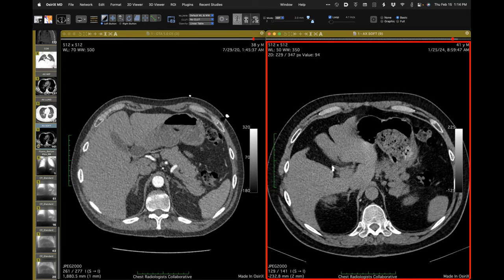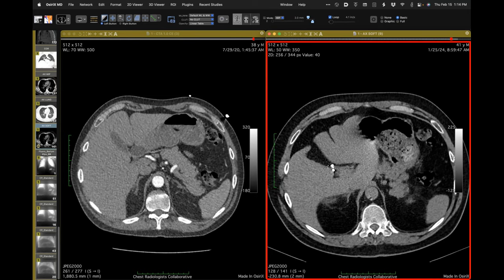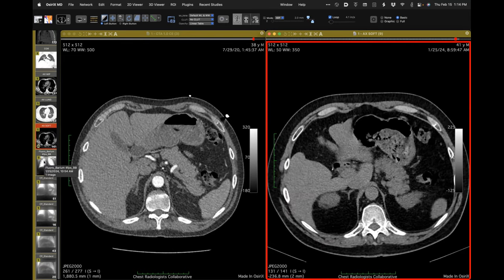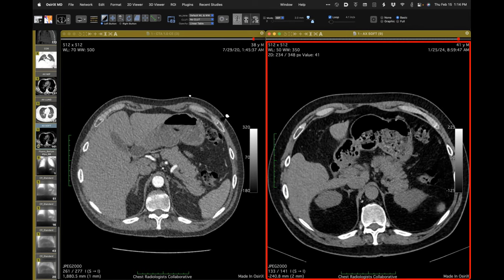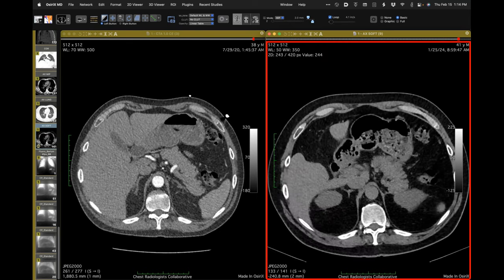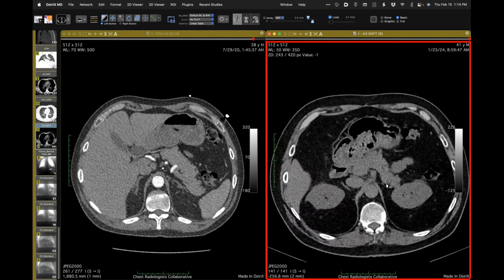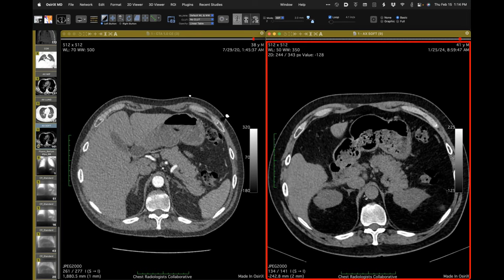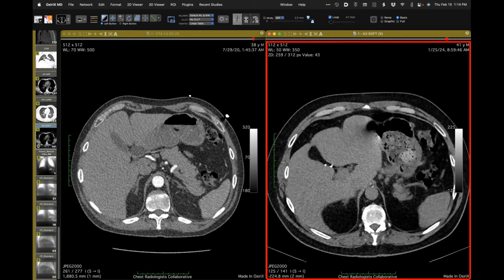There's still some muscle bulk here. The left crus does look a little bit thinner compared to the prior study on the left — it does look a bit thinner — but it's not really thin in other areas. Comparing the left crus on the recent study with the left crus on the prior study, it does look a bit thinner, but it's not consistently so throughout.